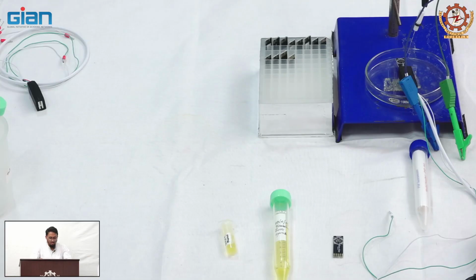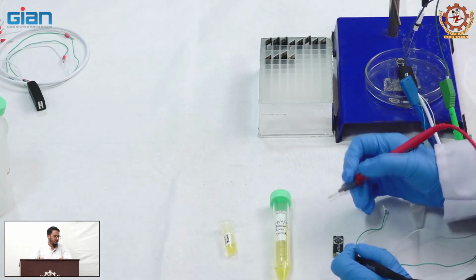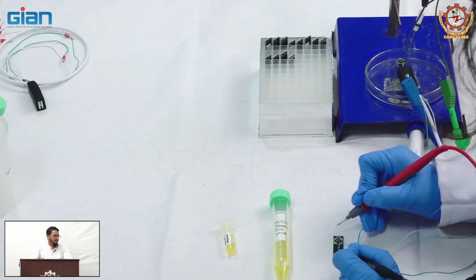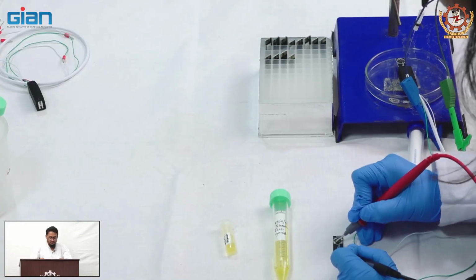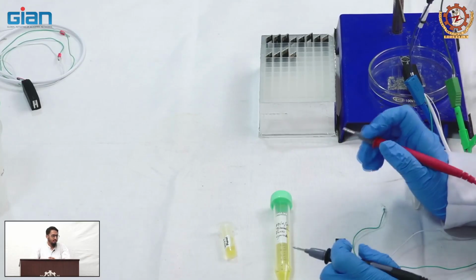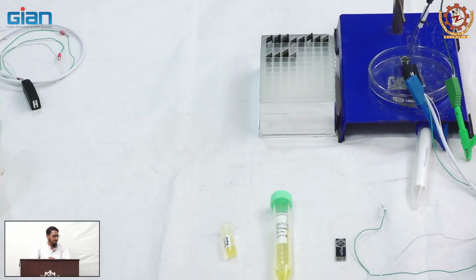So before we start electrochemical testing of the working electrode, first we will do just a connection test to make sure that the PCB based electrode is properly wired. For this we will be using a multimeter and we will do a connectivity test. So the beep actually tells us that the electrode is properly connected. As you have seen on the screen, the testing is successfully done. So now we will move on to test the working electrode electrochemically using cyclic voltammetry.